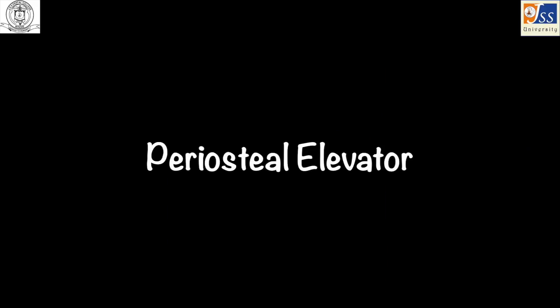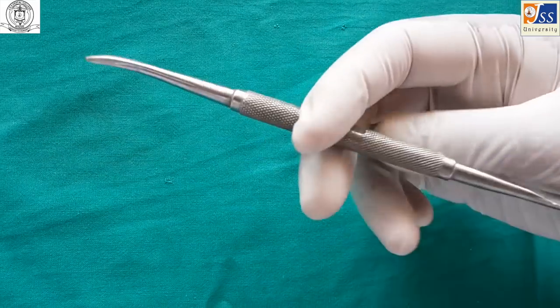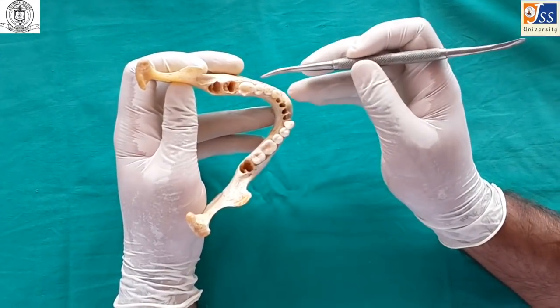The periosteal elevator is used for separating the mucoperiosteum from the tooth. It is held in a modified pen grasp, and is usually used in a push, pull, or pry motion.